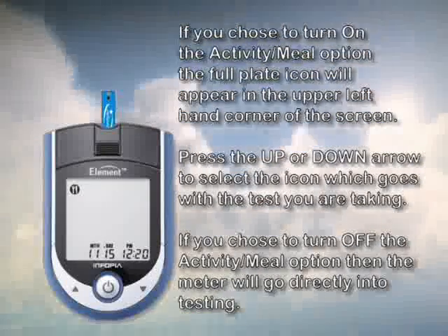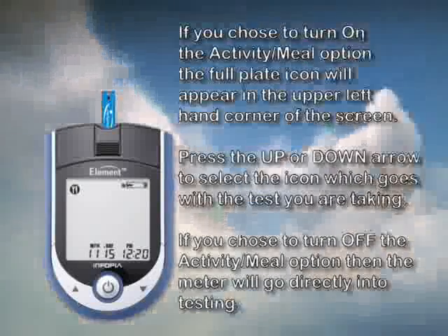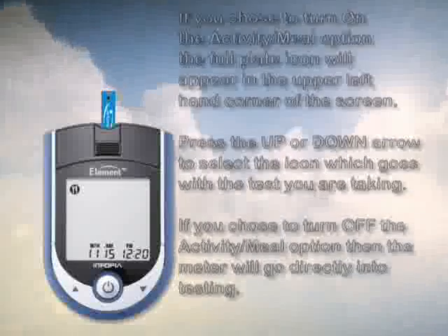If you do not choose the meal activity flag feature, your meter will automatically be ready for testing and again you will see a blinking test strip at the top.